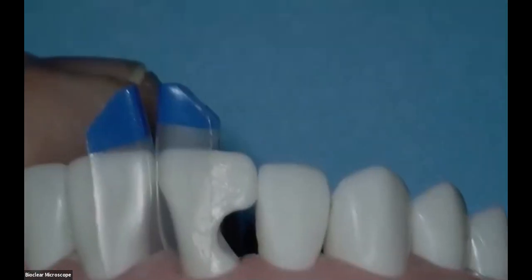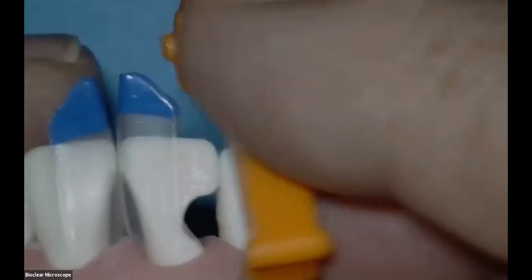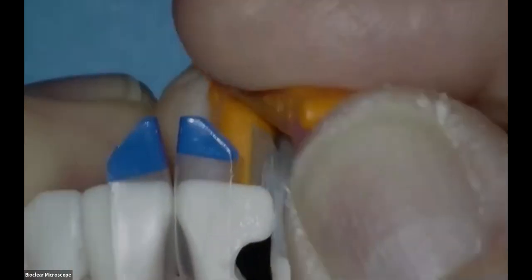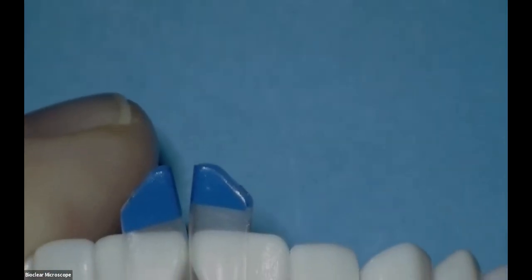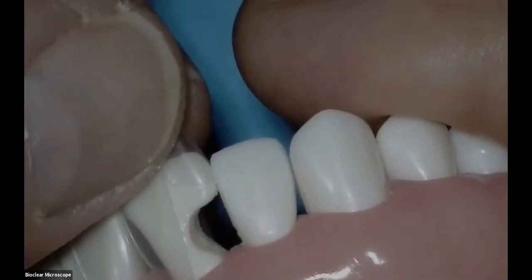So now I've got to go back in and sand the contact, because now that I have matrices here, this contact got tight. So I'm going to sand this to lighten the contact, but not open the contact. So I'm sanding here, and that's still pretty tight. Let me have the red sander one time. That's the double-sided sander, and that should allow the matrix to come in and seat all the way apically.